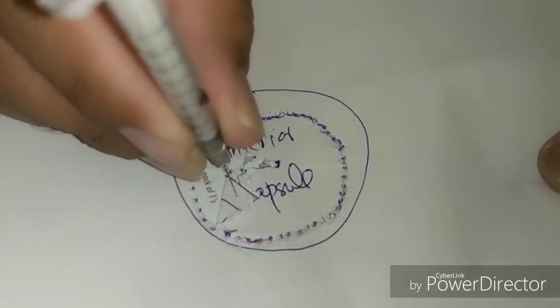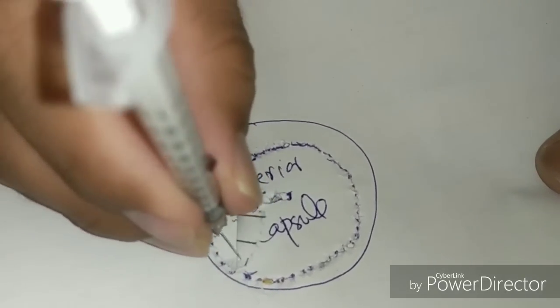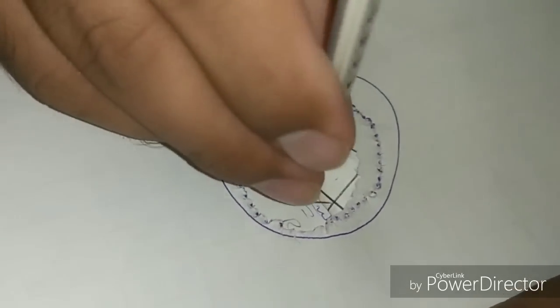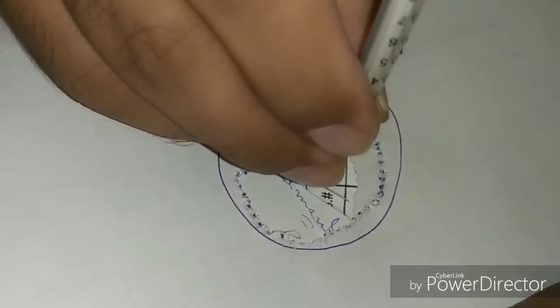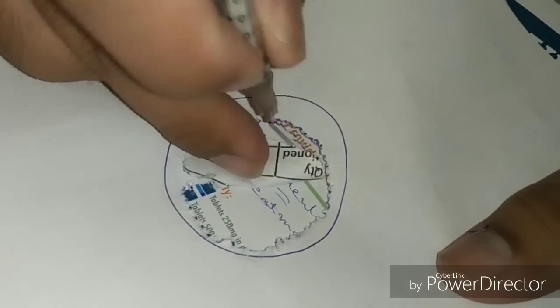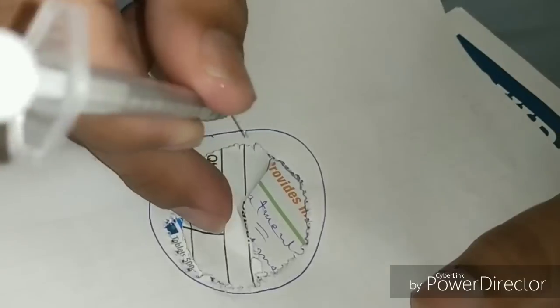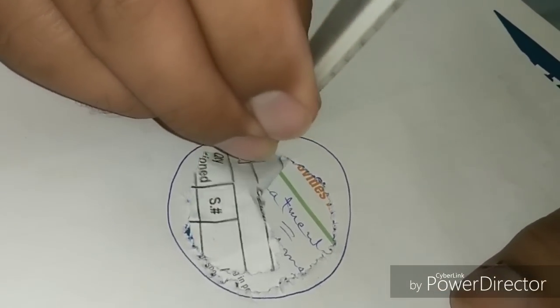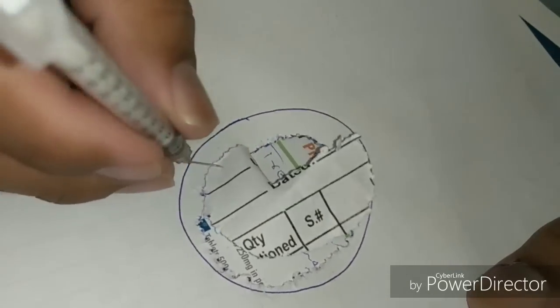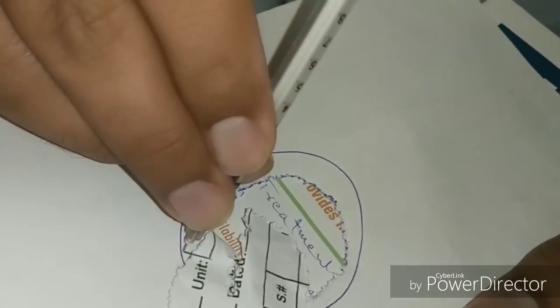Beginners can practice on plums as well. Flap creation is the most important step in capsulorhexis. After creating the flap, move the leading edge slowly and gradually; if it tears radially, come out, put viscoelastic, make the flap lie again, and then move it slowly to complete the capsulorhexis. A round and regular capsulorhexis makes phacoemulsification very comfortable and easy, and it is the most important step in phacoemulsification.